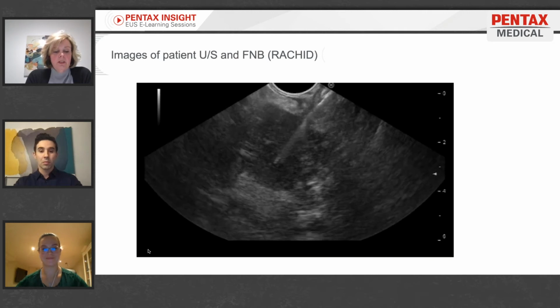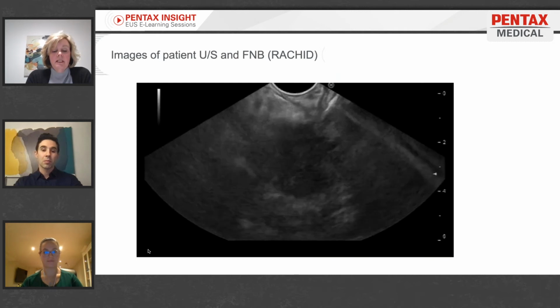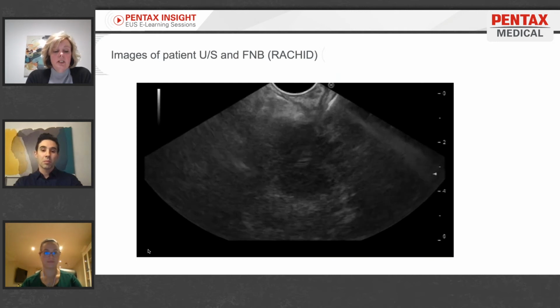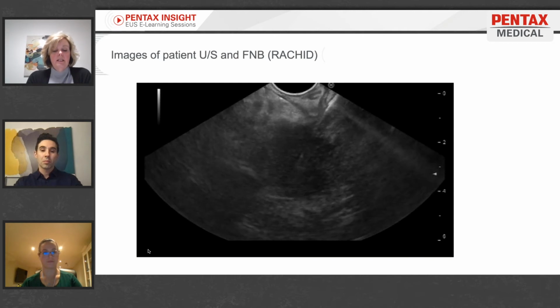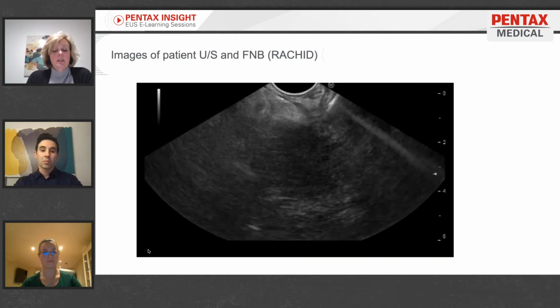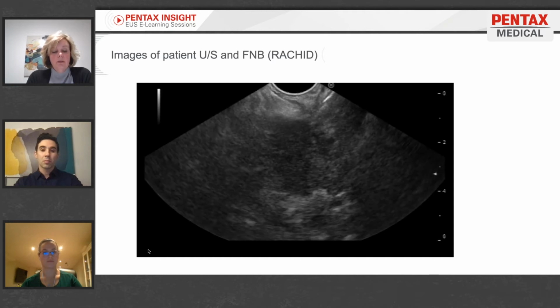Most EUS needles have 2 settings, one to adjust how far the sheath comes out the distal end of the scope, and the other adjusts how far the needle comes out the sheath. Prior to handing the needle to the endoscopist, ensure that the settings are correct and the screws are locked, so there's no movement when inserting the needle down the scope. The setting to determine how far the needle should come out the sheath should be set at 0, and the length the sheath comes out of the scope will differ depending on the scope and needle being used.